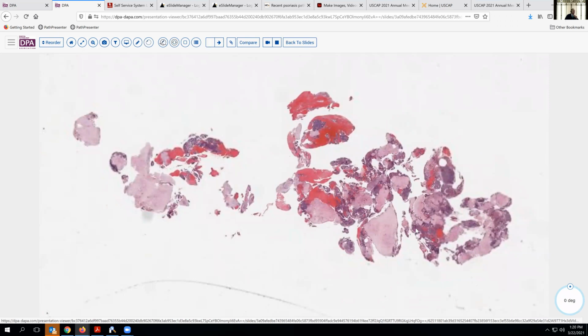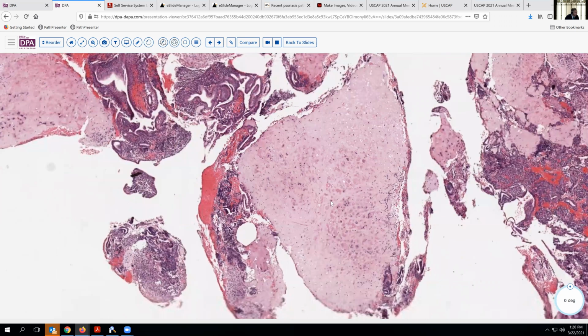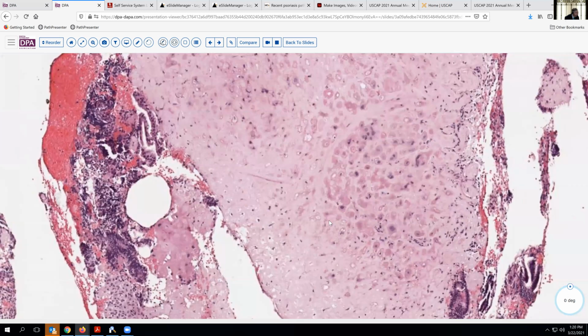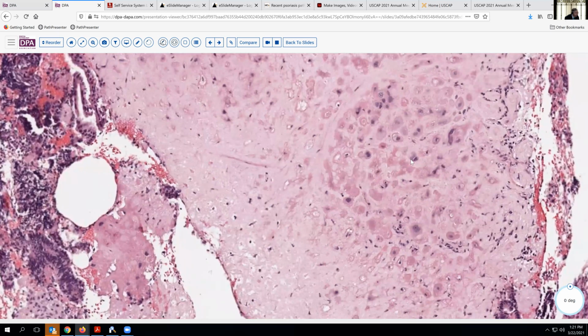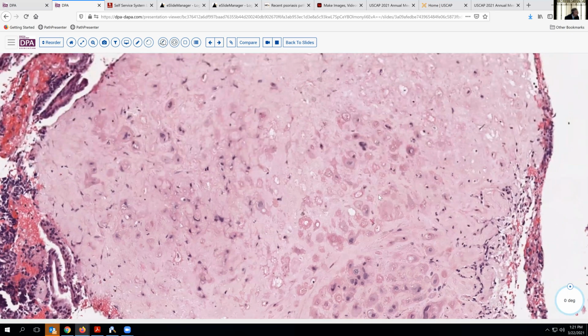All right, so here's a nice example of the placental site nodule. This in a curettage specimen. You can see here the nice eosinophilic hyalinized areas with interspersed, more typical endometrium. When we come into higher magnification on one of these areas, you can see that there is a degree of cellularity here. There are these cells with sort of pale pink cytoplasm and central, maybe smudgy nuclei, somewhat variable, a little bit of pleomorphism here, but not anything that really looks like confluent growth or tumoral type of formation.